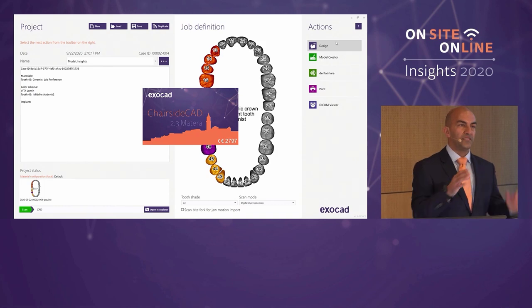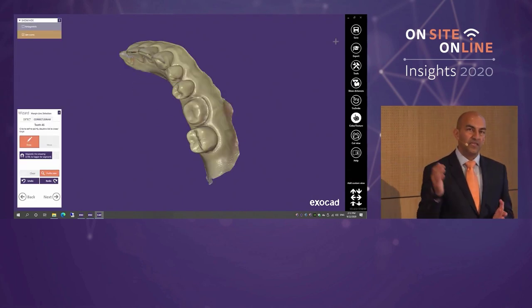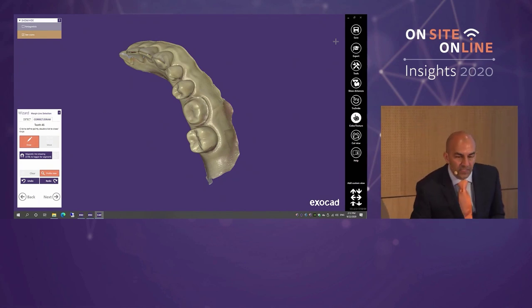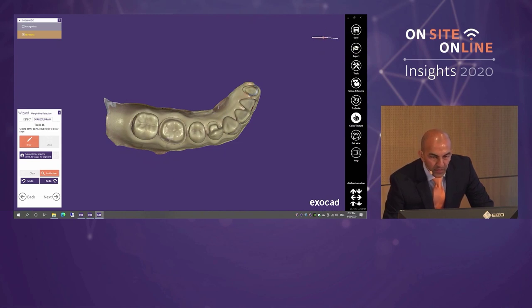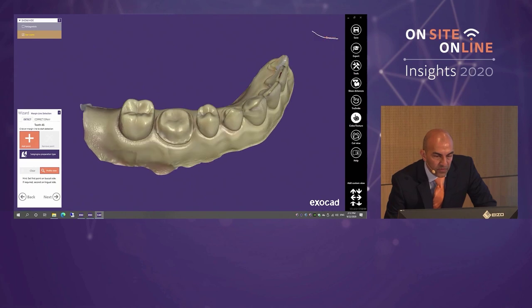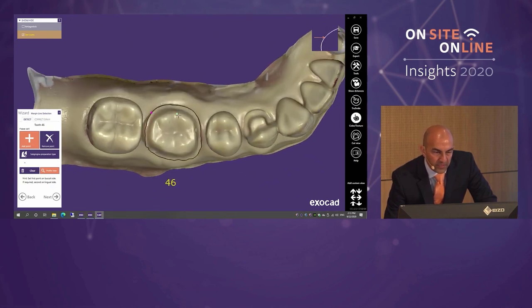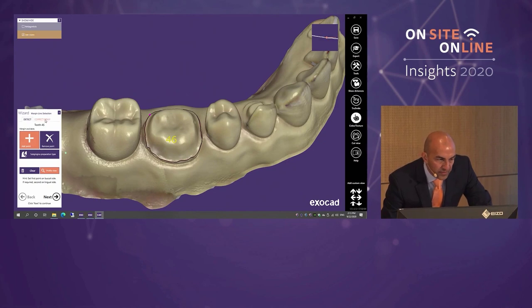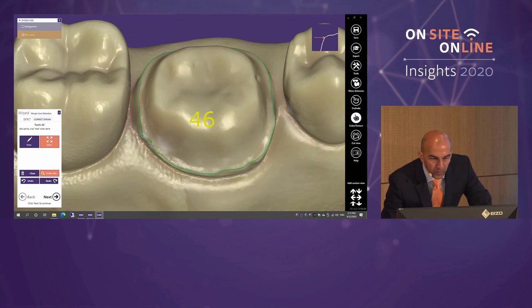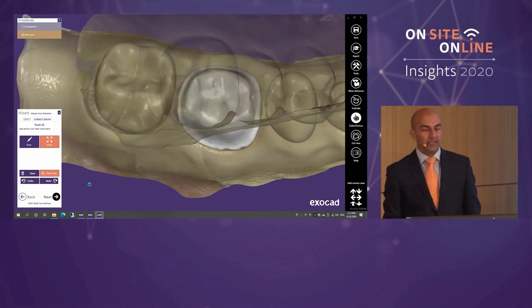There are two elements to every Exocad software platform: DB — the database — and CAD, computer-aided design. We were just in the DB element where we input data about what the CAD software should expect to receive. Now we're in the CAD element and I can see the data from scanning. The first thing the software asks for is the margin. This is a supragingival prep — I click one point on the preparation and within less than a second Exocad picks up the entire margin. You can then modify it using correct draw with multiple control points.